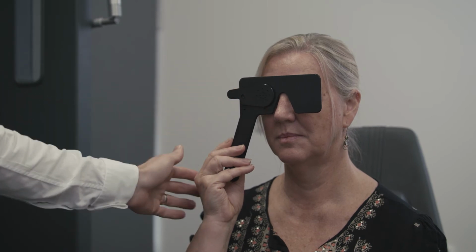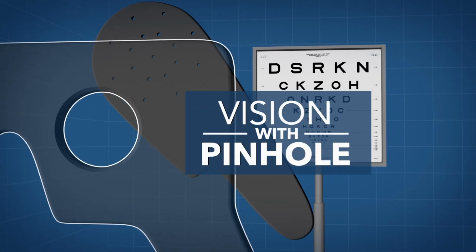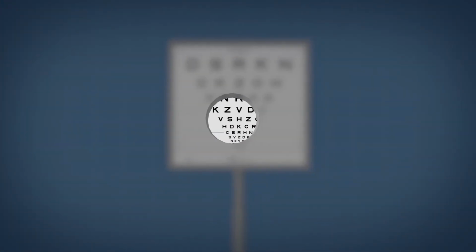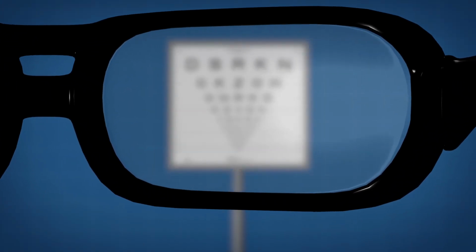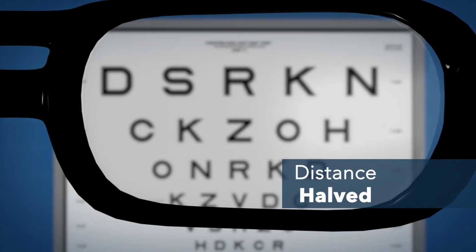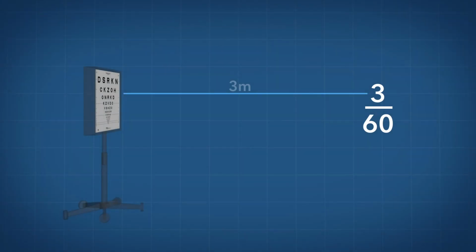If the patient doesn't achieve 6/6 vision, then cover the eye with the pinhole occluder. This can be placed in front of their distance glasses if they wear these. The pinhole focuses the light entering the eye, and if the vision improves with pinhole, this indicates that glasses would improve the vision. If the patient can't read the largest letter on the chart, then move the patient to half the original distance from the chart and recheck the vision at this distance. So for example, the vision would be expressed as 3/60 if they could read the top letter at a distance of 3 meters from the chart.